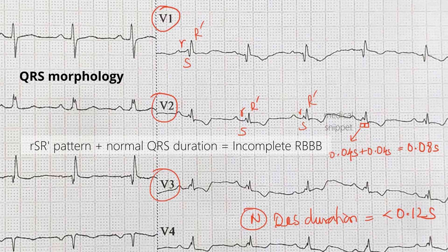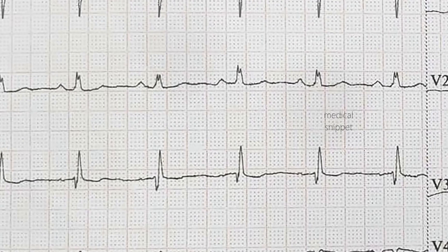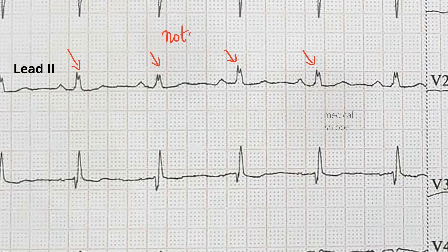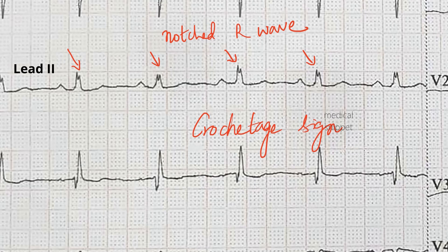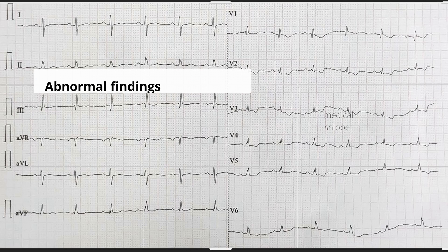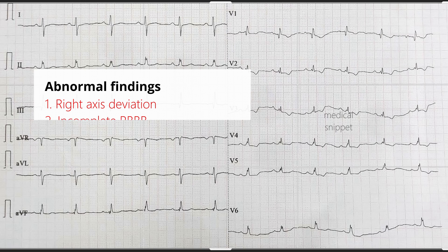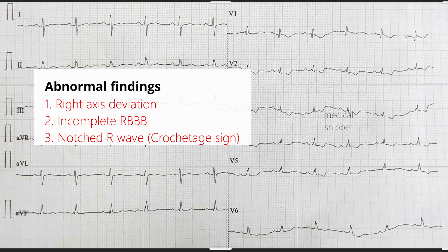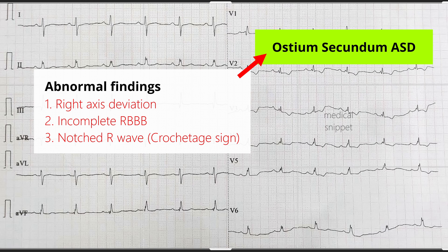One more abnormality seen in this ECG is notching of the R wave in lead 2. So let's summarize the abnormal findings: first is right axis deviation, second is incomplete right bundle branch block, and third is the notched R wave in lead 2. These findings point towards the diagnosis of ostium secundum atrial septal defect.